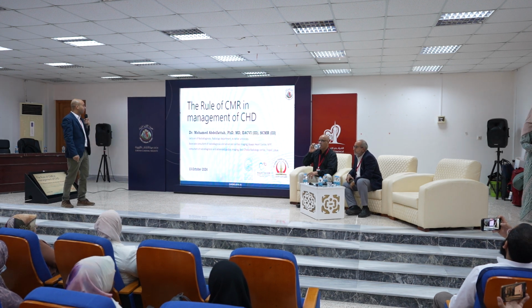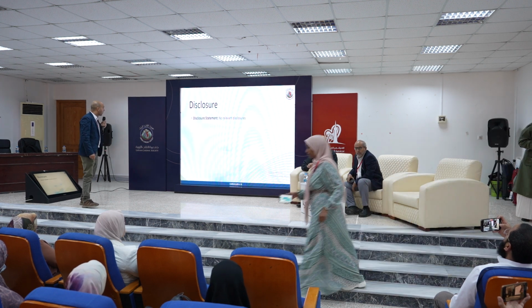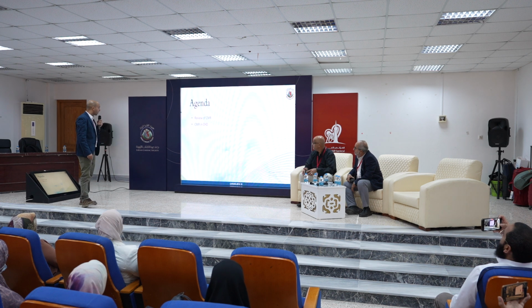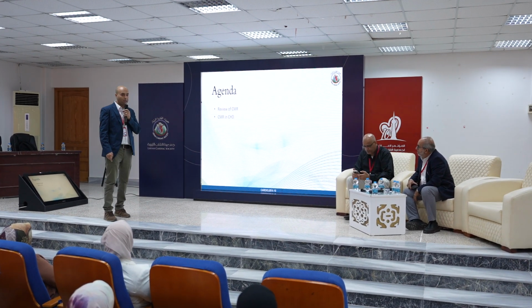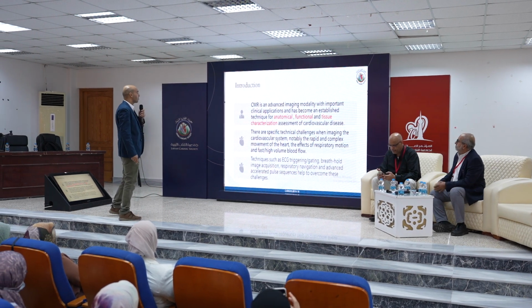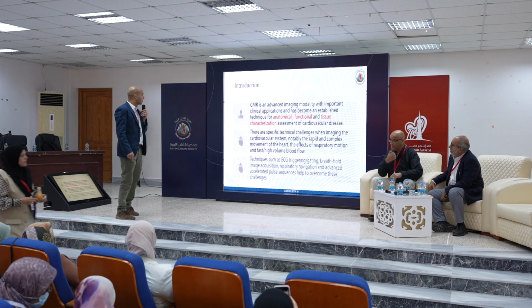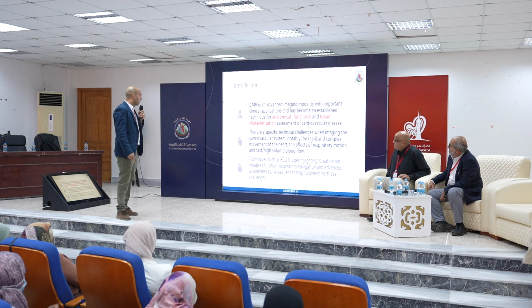The role of CMR in management of congenital heart disease. Agenda: we'll give a review of cardiac MR and the role of cardiac MRI in congenital heart disease. At first, CMR is an advanced imaging modality with important clinical applications. It has become an established technique for anatomical, functional, and tissue characterization.